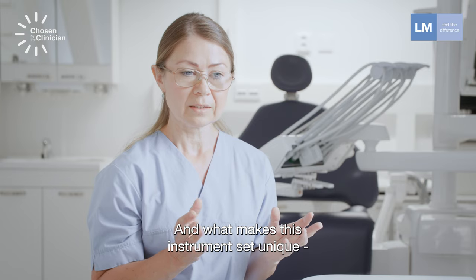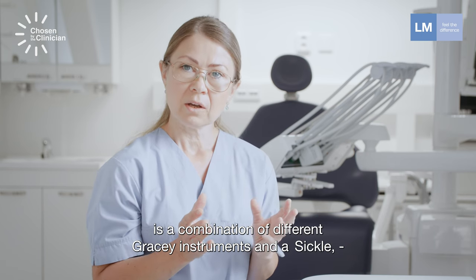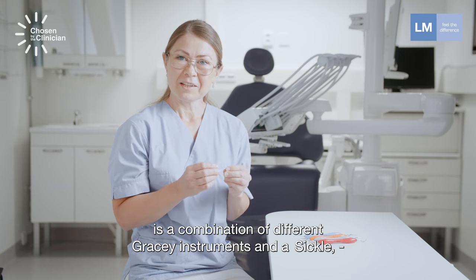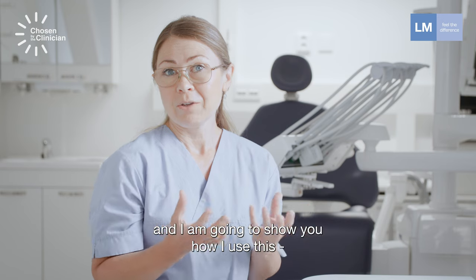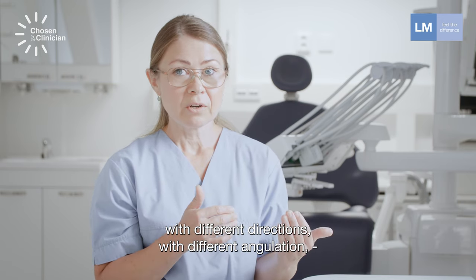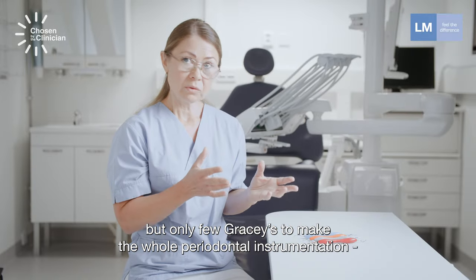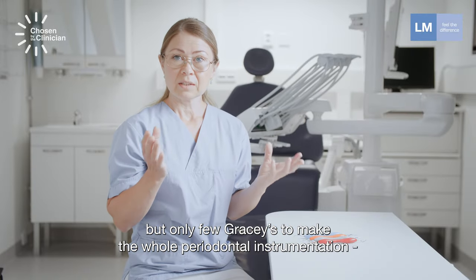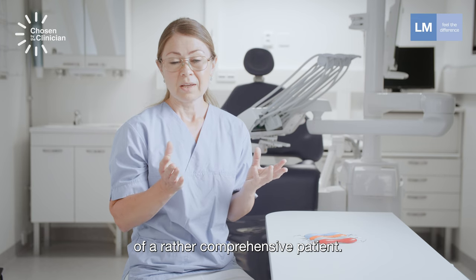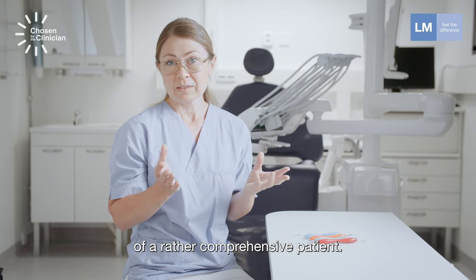What makes this instrument set unique is the combination of different Gracey instruments and a sickle. I'm going to show you how I use this with different directions and different angulation, but only a few Graceys to complete the whole periodontal instrumentation of a rather comprehensive patient.